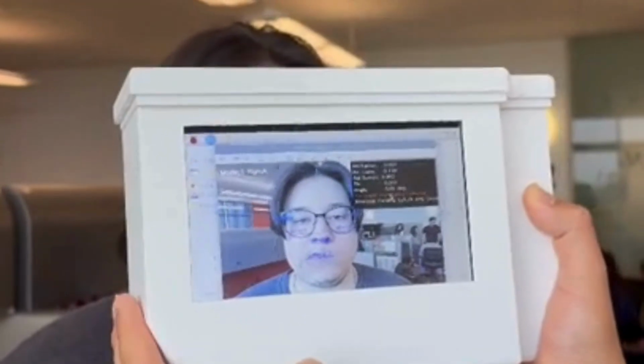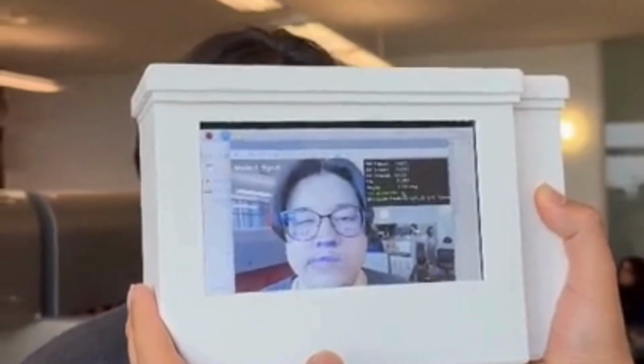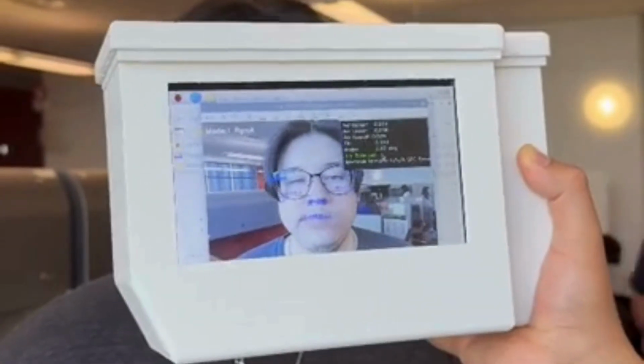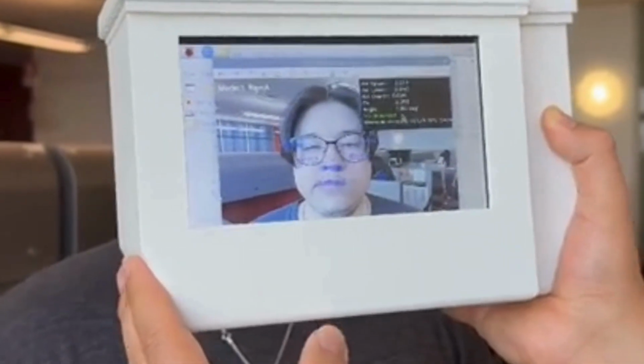Now, Jerome, let's try to see if we can do some eyes drooping. All right, maybe a little scrunch. Let's get a little scrunch. So that one's not as sensitive, so we're still troubleshooting that. But with the lower asymmetry, we're able to detect and pick up those asymmetrical indexes.